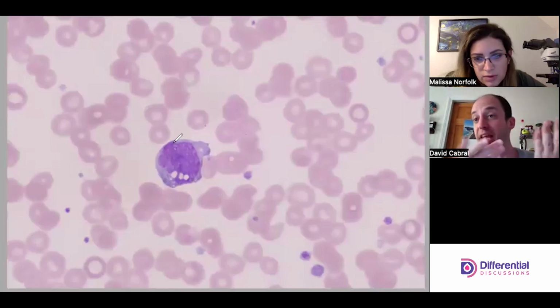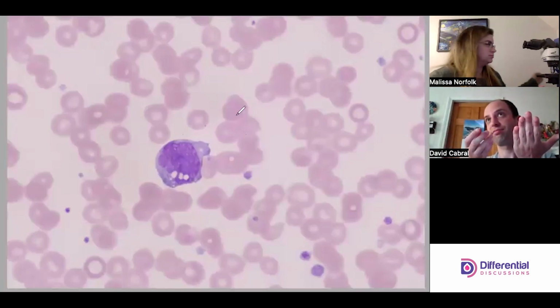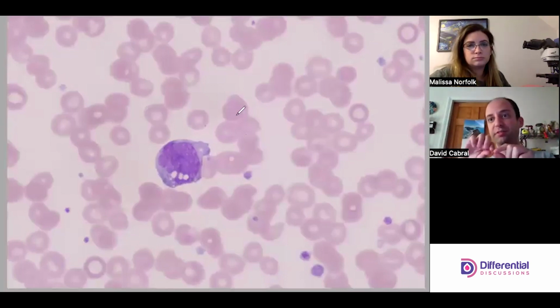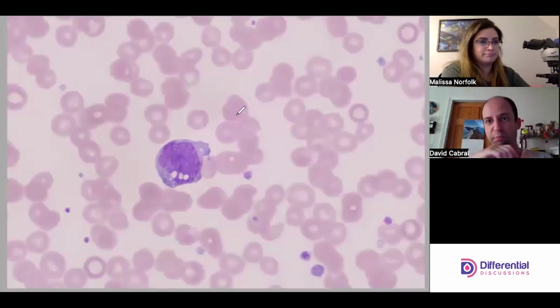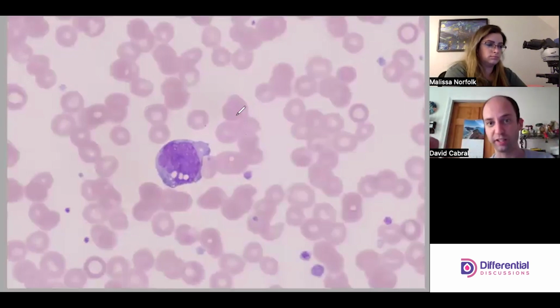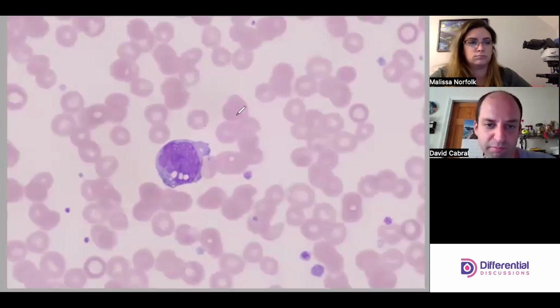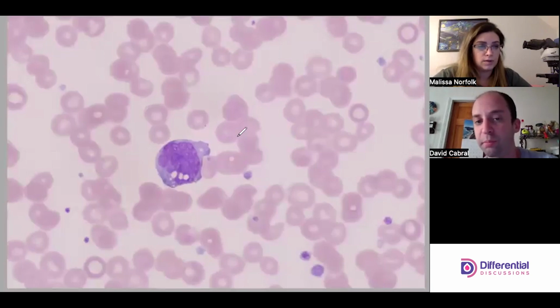Could be the way. So another thing too is when we think about a nucleus and the chromatin wrapped around histones and how it's packaged, Melissa used the term striations, right? So I think of string, and depending on how a nucleus like this is folded and how the cell is oriented in space, visually it can appear a lot of different ways.